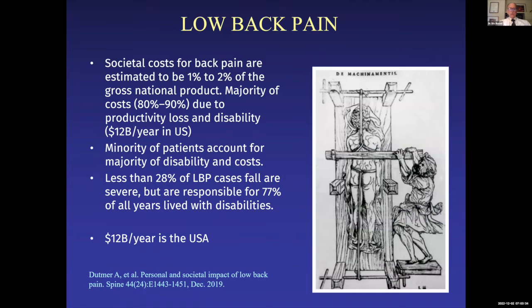I'm going to talk primarily about degenerative disease. I may touch upon a few related conditions as time permits, but we're going to concentrate on the most common causes of back pain.